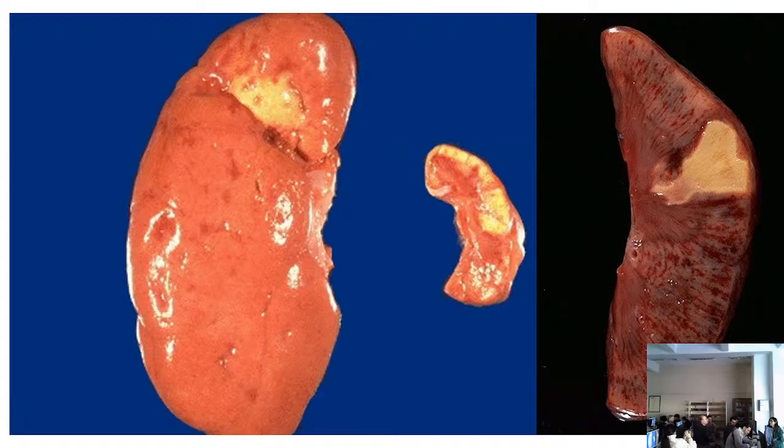Yes, please. That area doesn't have another source of blood. Yes, there is no adjacent circulation. We have the acute blockage of the artery. This is the type of infarct. There is no adjacent circulation so that blood comes to the necrotic place from any other side, because renal arteries are terminal arteries. There is no branching. So a renal infarct is by definition pale.